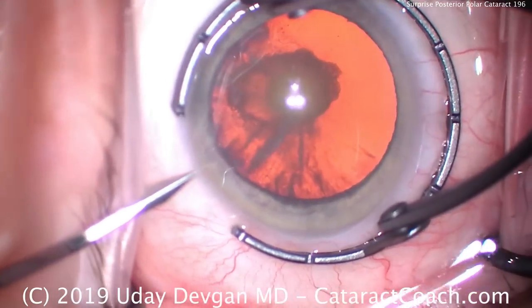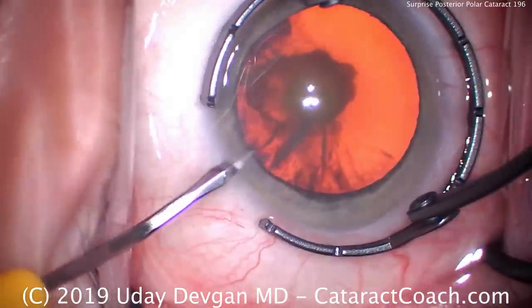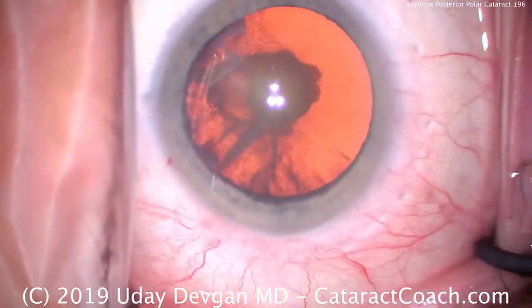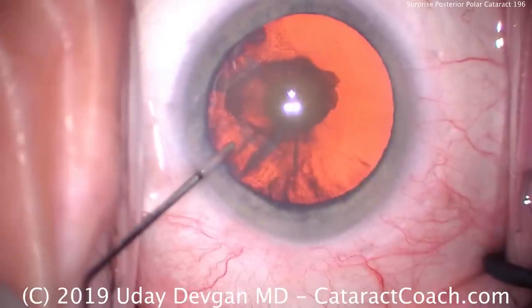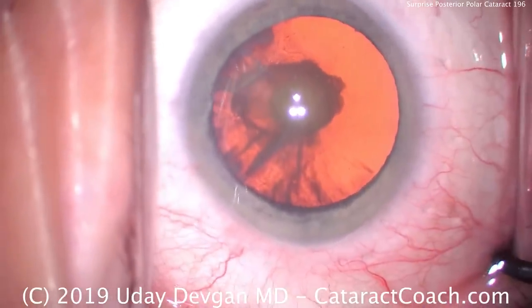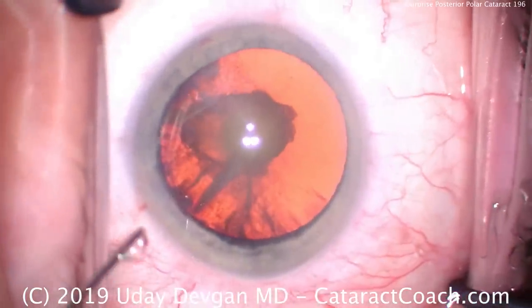It's cataractcoach.com, and look carefully — this is not just a posterior subcapsular cataract. This is a posterior polar. Do you see the round outline of the dense polar opacity? I got a little surprised here because this patient was booked and I recall seeing a posterior subcapsular cataract, but here with that red reflex, I really see the posterior polar nature of it.